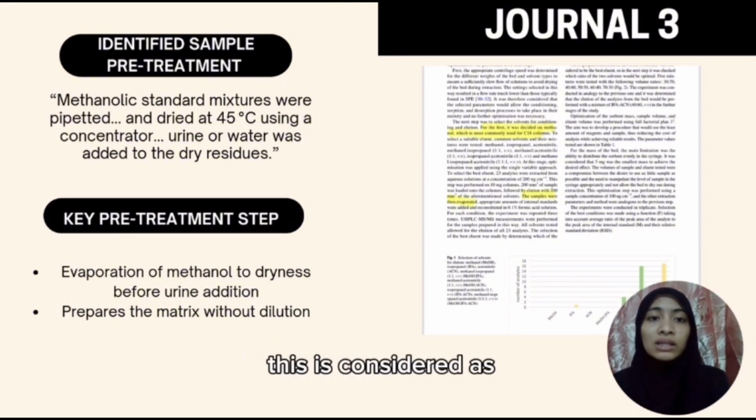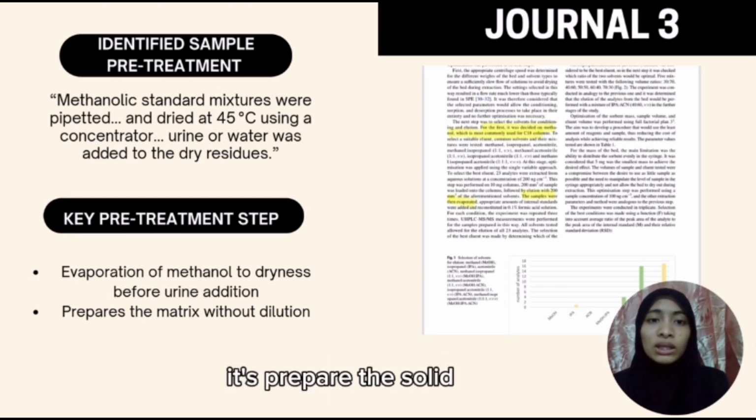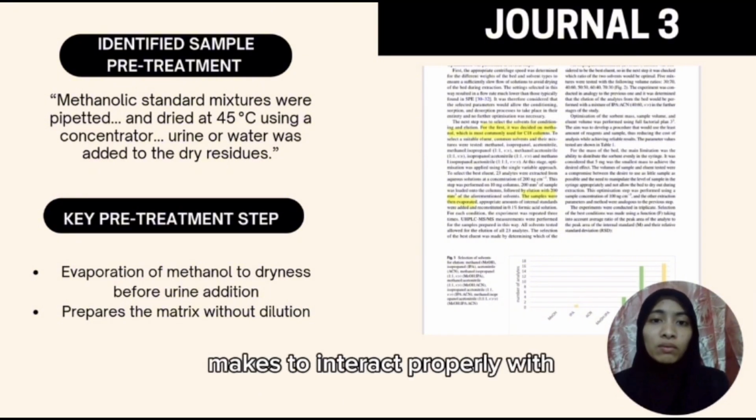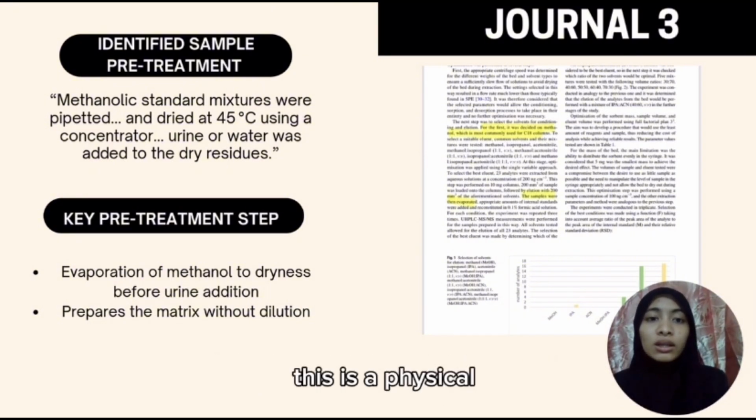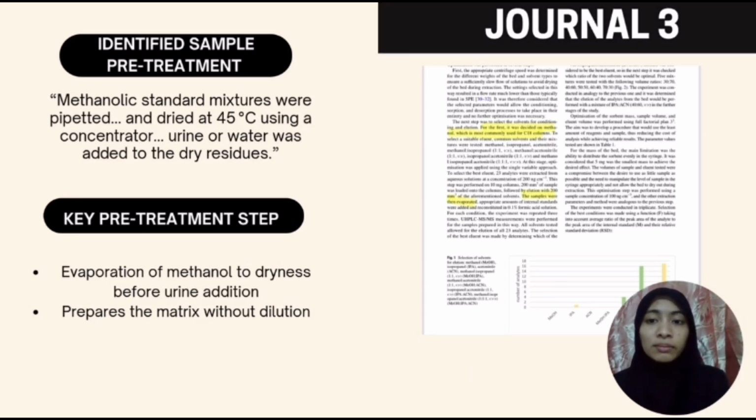This is considered a pretreatment as the evaporation step removes methanol, which could interfere with the downstream step. It prepares the solid analyte mix to interact properly with the urine matrix. This is a physical pretreatment step that ensures sample uniformity and avoids solvent interference in the SPE process.